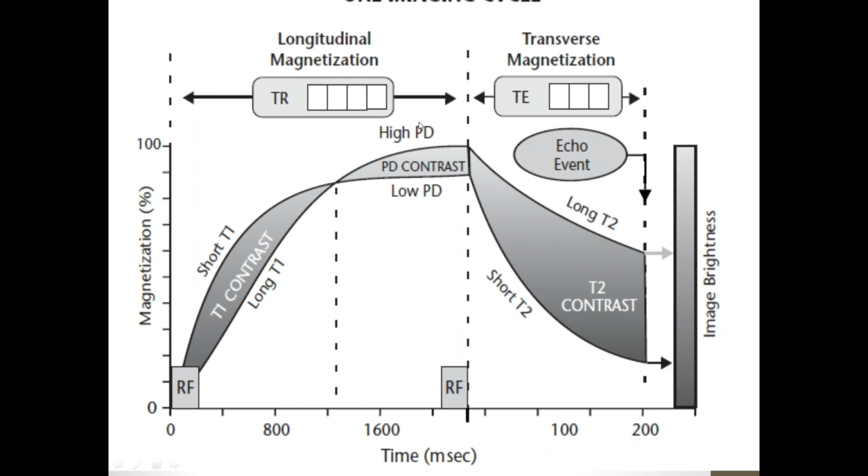If two different tissues give you different signals, so there is a difference in the signal, so you can get a difference in the image, a difference in brightness, a difference in grayscale. But if the signal coming out from different tissues has the same value, with no difference, you will represent it with the same grayscale, with the same color.